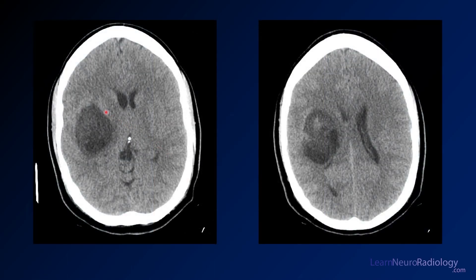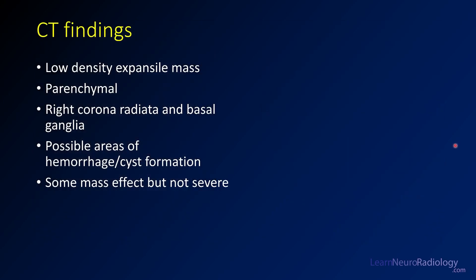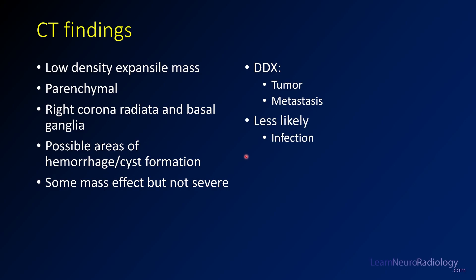Here are some additional images from that CT. You can see those components a little better — a little hyperdensity, maybe blood products, maybe a little bit of calcification. So a little more complex than the tumor we saw in the other study. Again, a low-density expansile mass in the parenchyma. We see a little hemorrhage, maybe some cysts, and some mass effect but not severe. The differential is similar to the previous case — tumor or metastatic disease. Infection may be a little less likely because of those complex features. This patient is going to need an MRI — that's the next step.